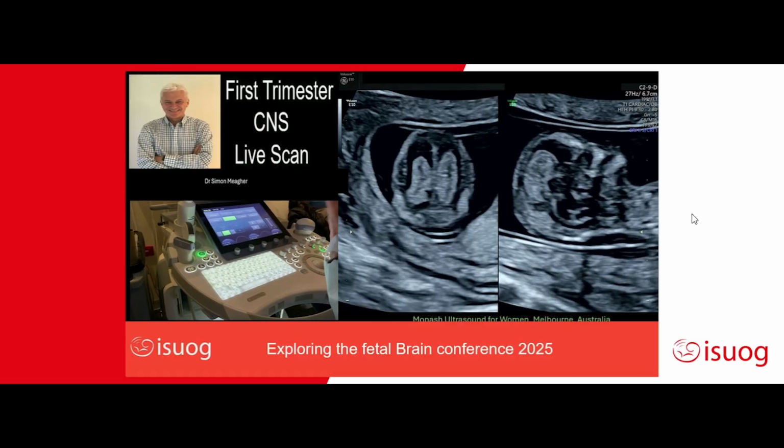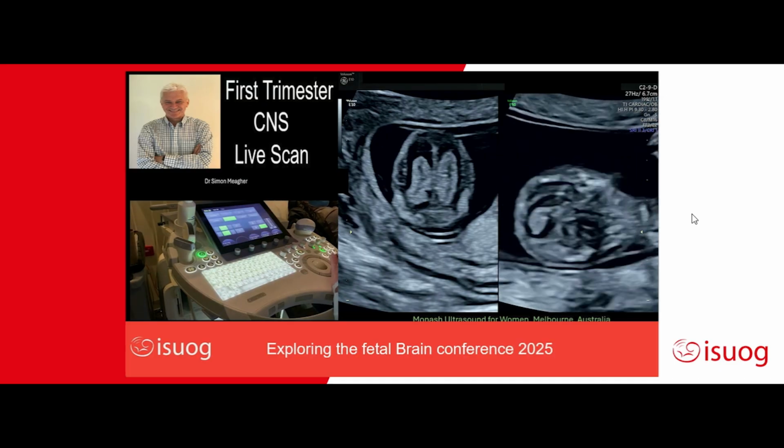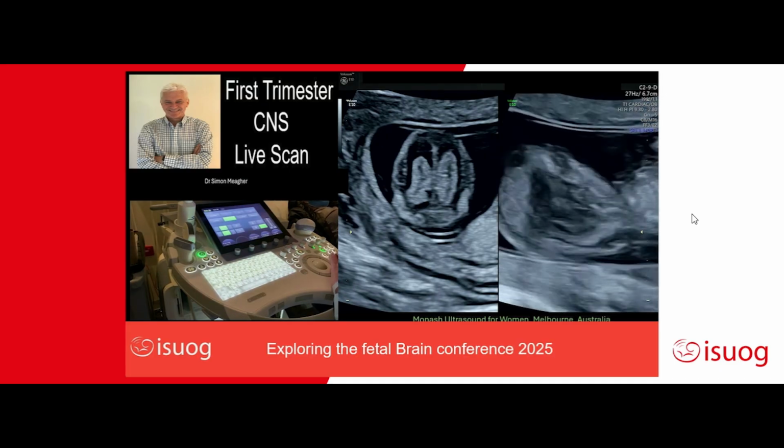And you can see it's not a perfect sagittal because, quite frequently in getting these brain landmarks, it's parasagittal or it's oblique, and in this case it's slightly oblique. So it's absolutely right for measuring the brain, but not perfect for measuring the nuchal translucency. So that's the most predictable way of getting the intracranial landmarks.